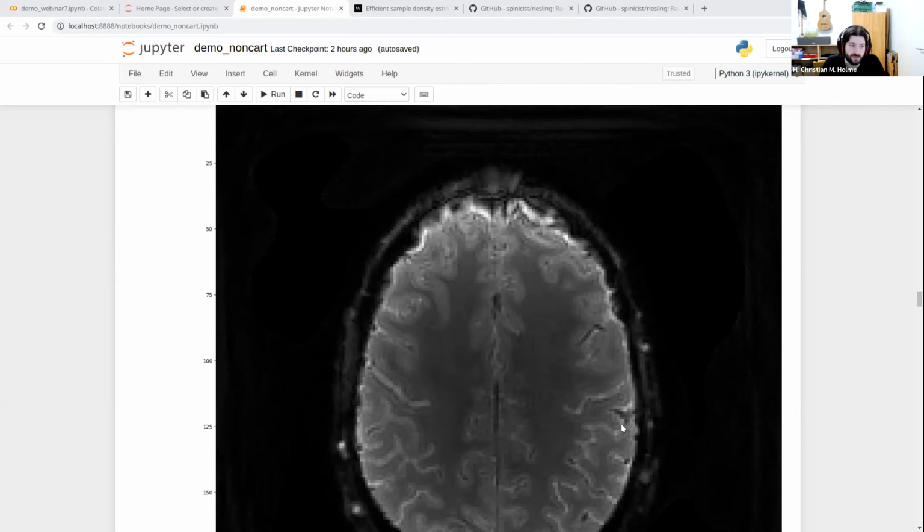I think that's actually one of the problems, that this trajectory calculation can be done in so many different ways that we only support the ones that lots of people use or that our sequence uses. And it's a bit of an issue. I mean, it's certainly an interesting problem, and nothing really prevents us from using our methods also for 3D radial data, and by extension for 3D spirals such as yours, but we just haven't done it yet. Okay, thank you.